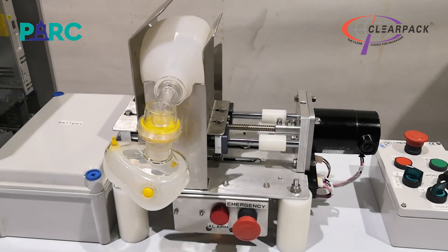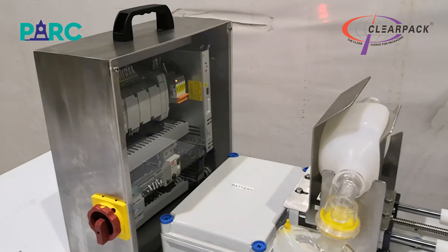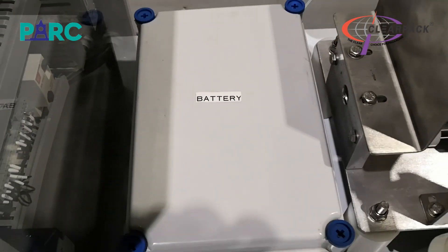This respirator consists of the mechanical module with the Ambu Bag, the control module, and the operator pendant, as well as an optional battery pack. While the respirator is powered from a standard 13 ampere wall socket, it can also operate on its own optional battery pack for up to one hour.